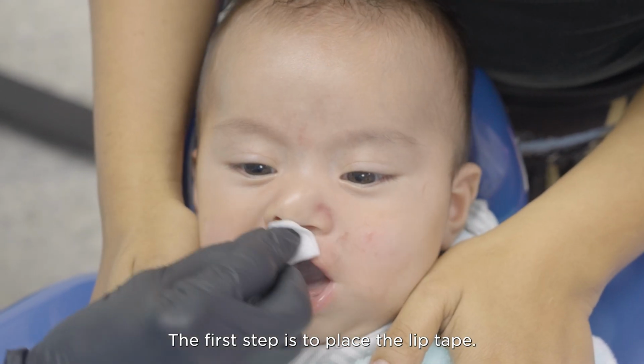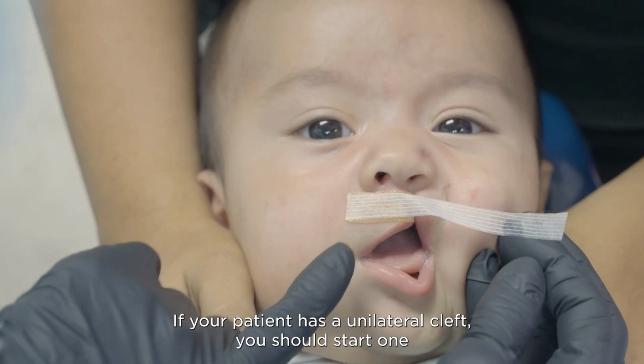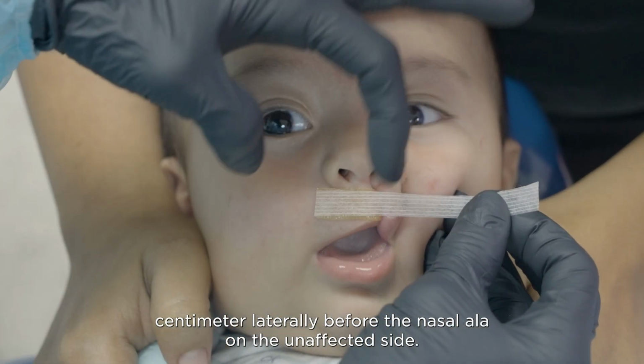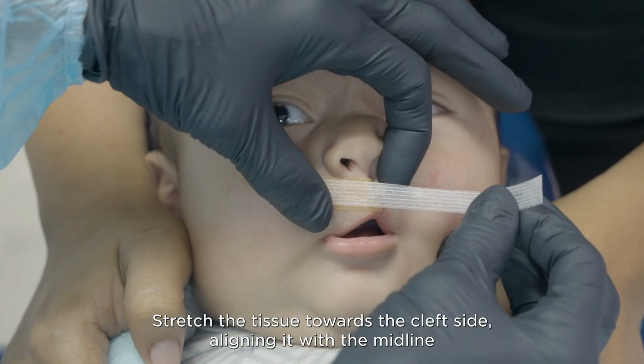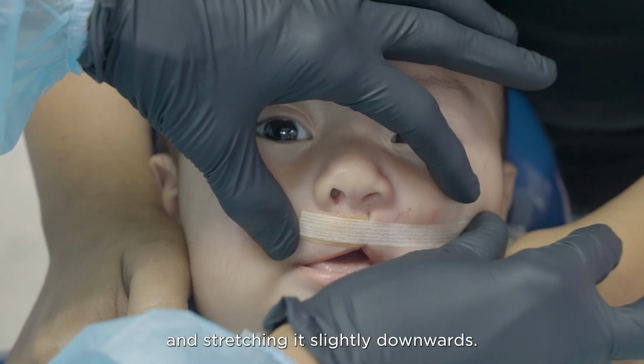The first step is to place the lip tape. If your patient has a unilateral cleft, you should start 1 centimeter laterally before the nasal ala on the unaffected side. Stretch the tissue towards the cleft side, aligning it with the midline and stretching it slightly downwards.